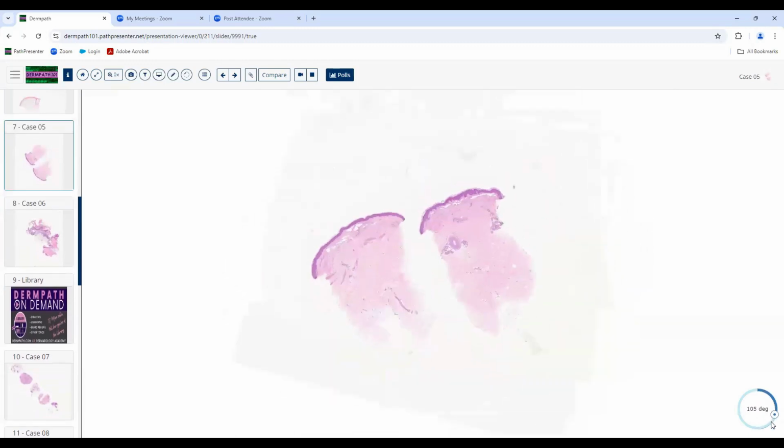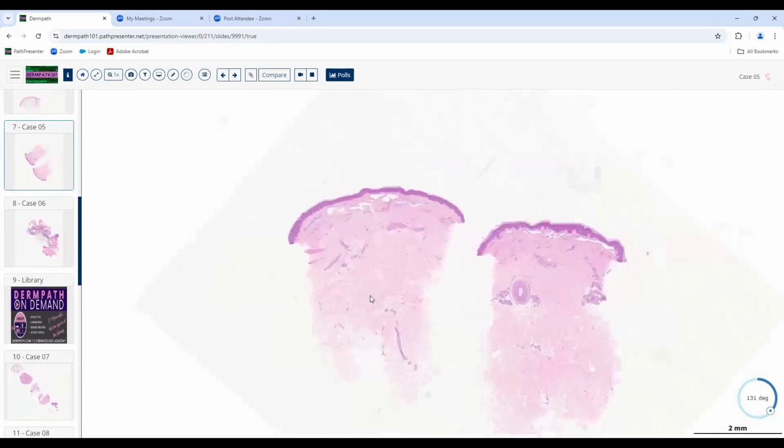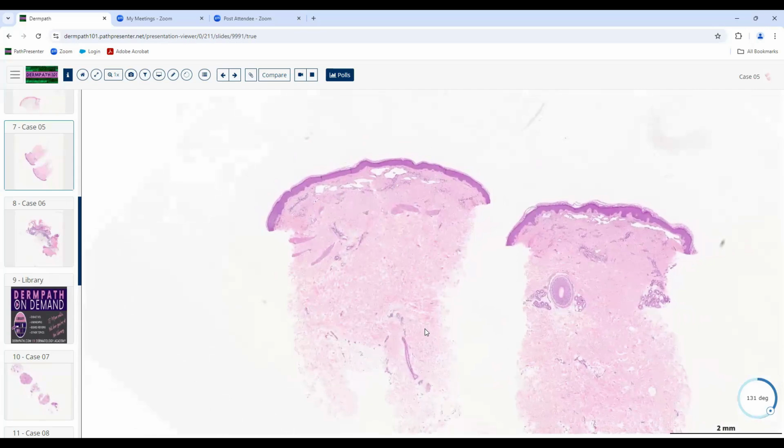Okay. Another example here of a neoplastic process, a punch biopsy. So we see something at low magnification that's got spaces in it, like here. We should think right off the bat that it could well be a neoplastic process of vascular differentiation. And for vascular differentiation, there are really 2 main types of vessels. We've got blood vessels, and then we've got lymphatics. So lymph vessels and blood vessels, basically those 2 things.